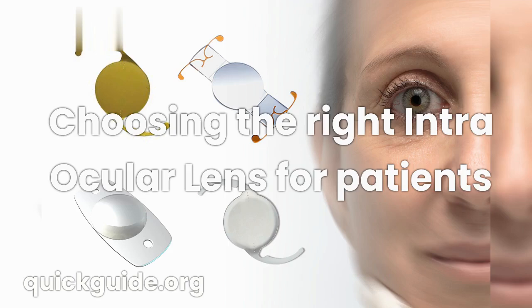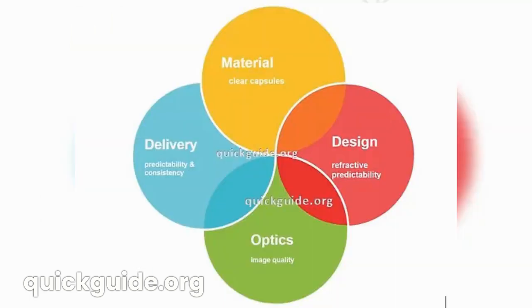In this video we will concentrate on intraocular lens features and certain aspects that one must keep in mind when choosing the right intraocular lens for patients. The characteristics and features of all IOLs can be broadly clubbed into the following heads: material, design, optics and delivery.